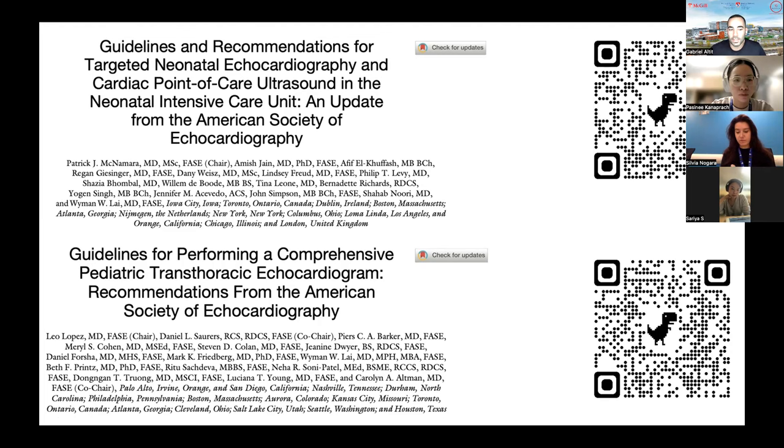And it really helps to standardize so that we can make sure that the research that we do or the publications that we do are based on a similar language. And most of the time, when we standardize measurements, it's because there's already been a body of literature that has produced data on some of these measurements, and they've actually published it in that fashion.